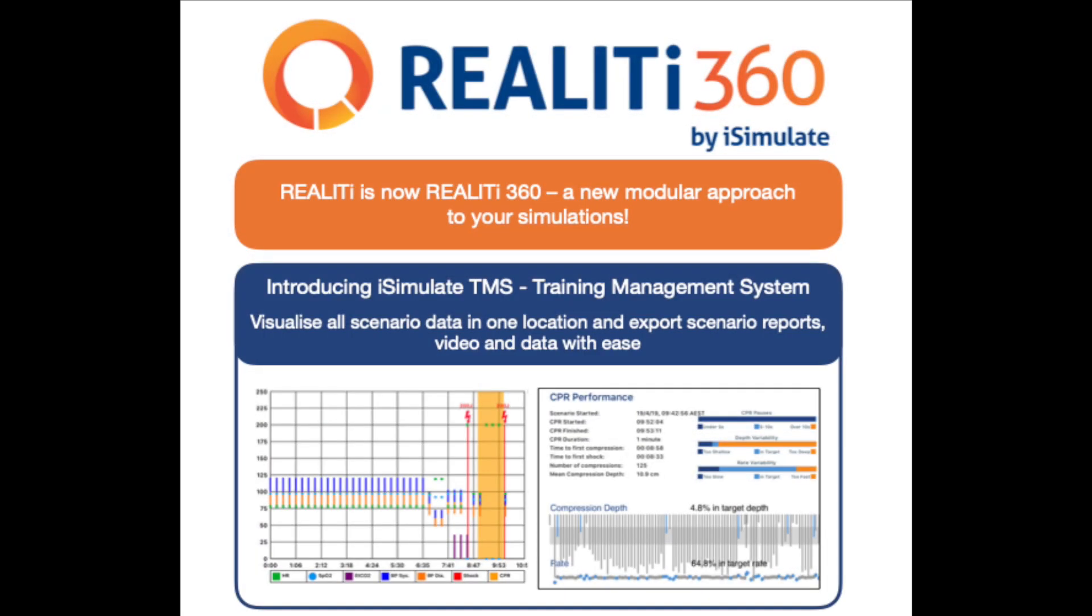Hi, it's Anthony Lewis here, the Medical Director at iSimulate. This video is an introduction to one of our new features in Reality360, our training management system, the TMS.